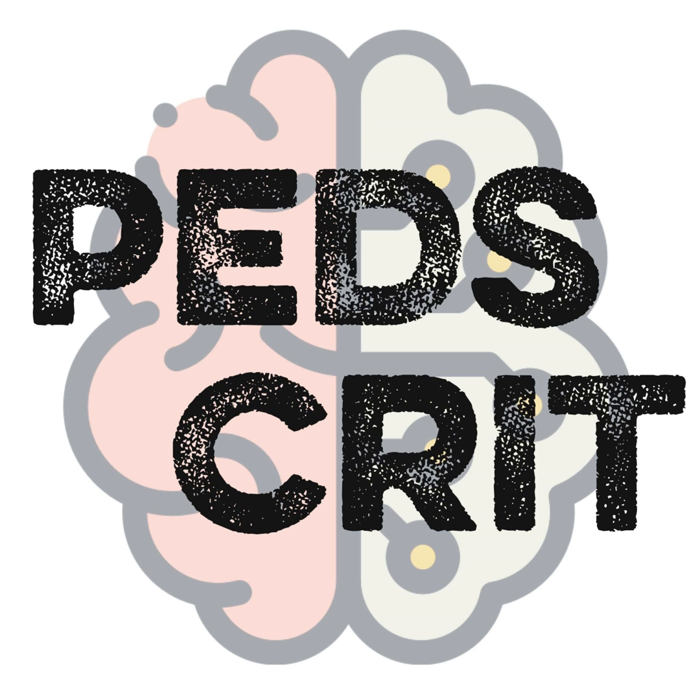Oh, so that's wonderful. So slow inspiratory, fast expiratory, we can all kind of picture the secretions moving well with that. Now, one thing that's different about APRV than the oscillator or percussive ventilation is that you lose your end tidal CO2 with the oscillator or percussive ventilation. And APRV is nice because you can still walk into your patient's room and see a couple narrow end tidal CO2 spikes on the monitor. Are you trusting the value? Are you wanting frequent gases for the CO2?